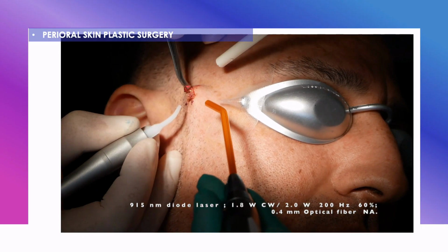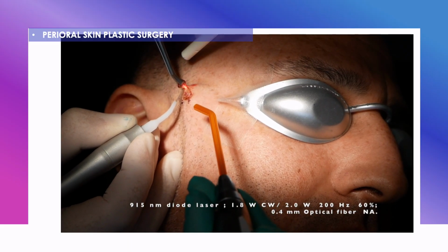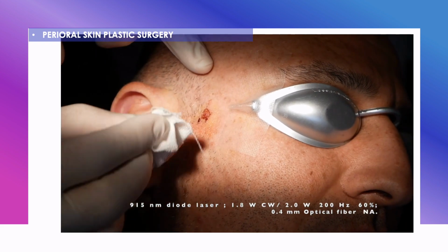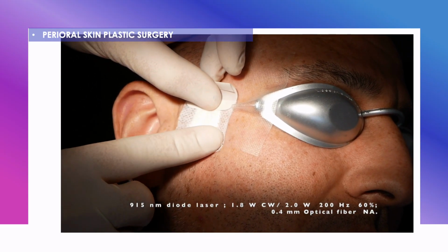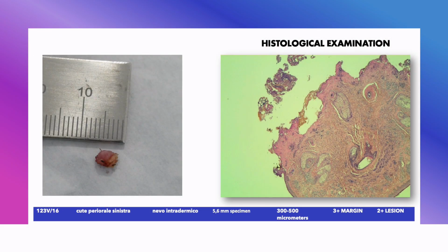The second surgeon or the second operator gently flushes some cold air to diminish the temperature increase over the laser tissue surface. After the completion of the procedure, a sterile gauze is applied gently over the skin area, and the surgical wound is covered with a sterile patch, which must not be removed for at least 24 hours. The bioptic specimen is then collected, measured, and sent to the pathologist for histopathological examination.